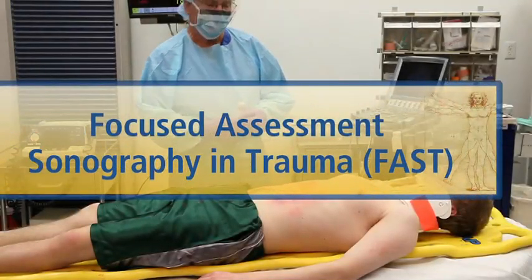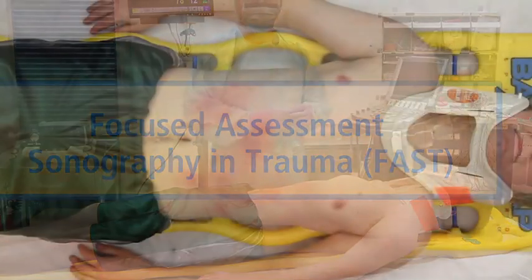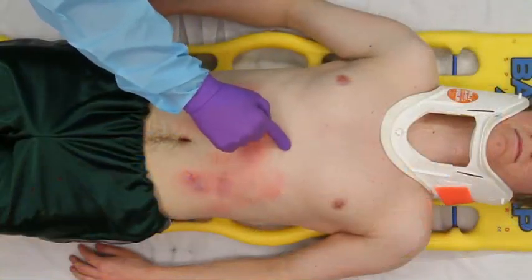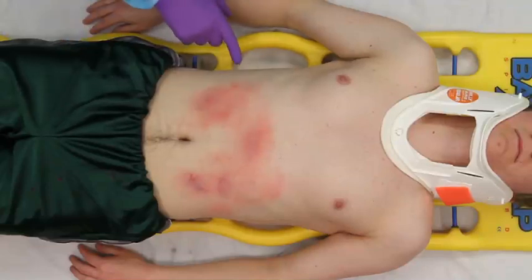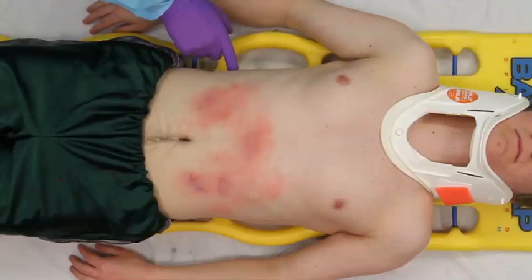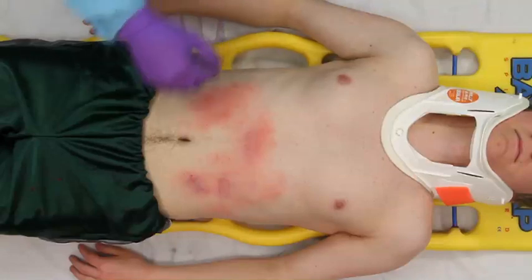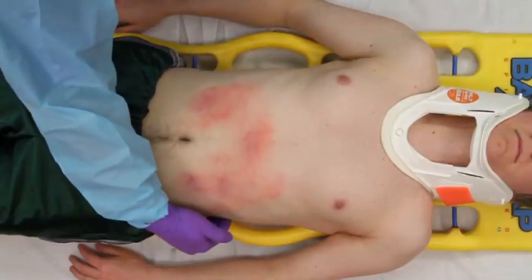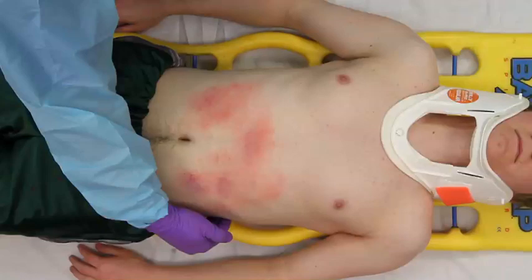There are four standard views in the FAST exam: the pericardial view, the right upper quadrant view — including the interfaces of the diaphragm and liver, and the liver and right kidney in Morrison's pouch — the left upper quadrant view, including the diaphragm-spleen interface and the spleen-kidney interface, and the suprapubic view.